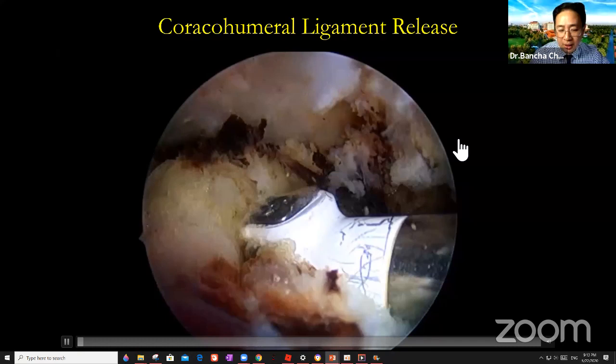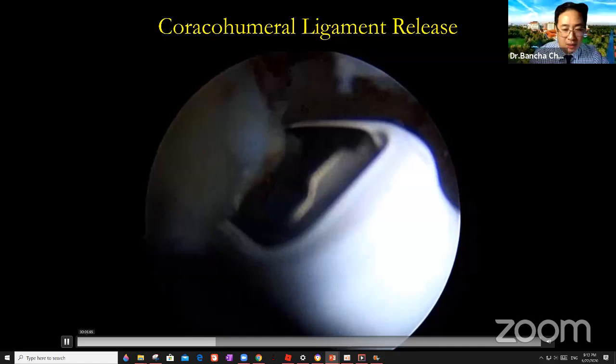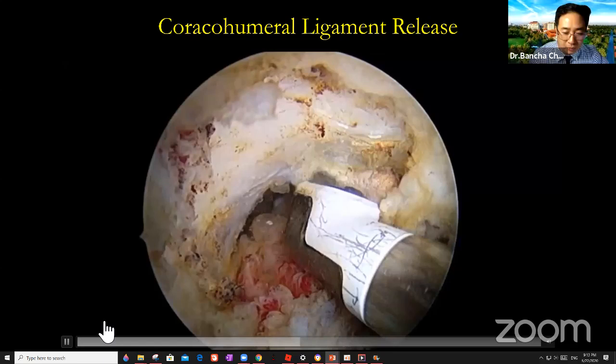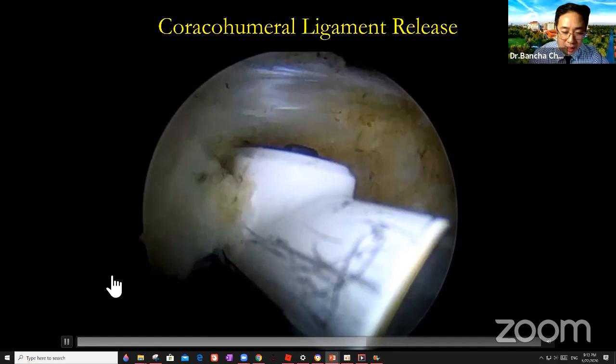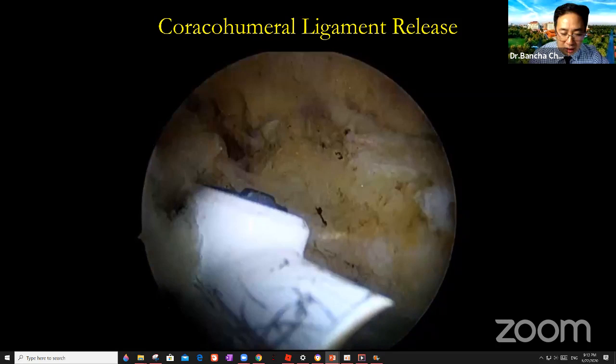So the next thing, I need to release the coracohumeral ligament. Identify the coracoid process, see that? This is the coracoid process, the tip is here, so this is the base of the coracoid. After you release the coracoid base, yeah, that way, and this is the scar tissue. Remove this piece of bone away from the coracoid, from the subacromial space. I think this is a very critical point. After that, the piece of bone is getting mobile.